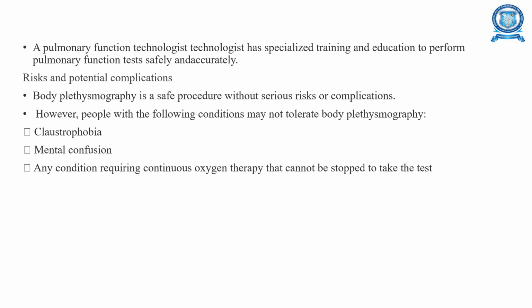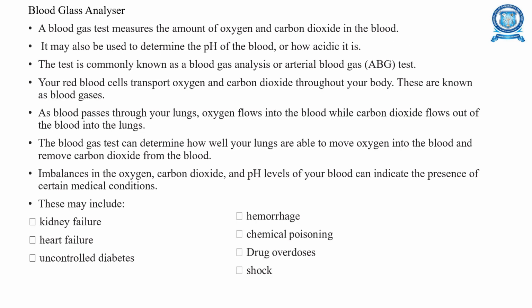A pulmonary function technologist has specialized training and education to perform these pulmonary function tests. Risks and potential complications: it is a safe procedure without serious risks and complications. People with the following conditions may not tolerate body plethysmography: claustrophobia, mental confusion, or any condition requiring continuous oxygen therapy that cannot be stopped to take the test.